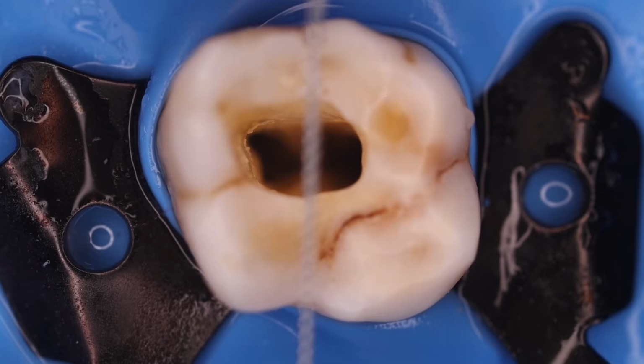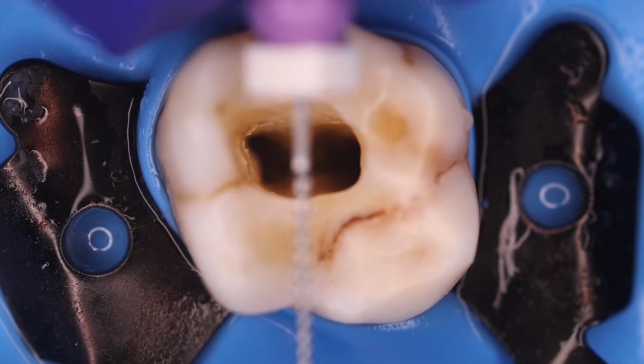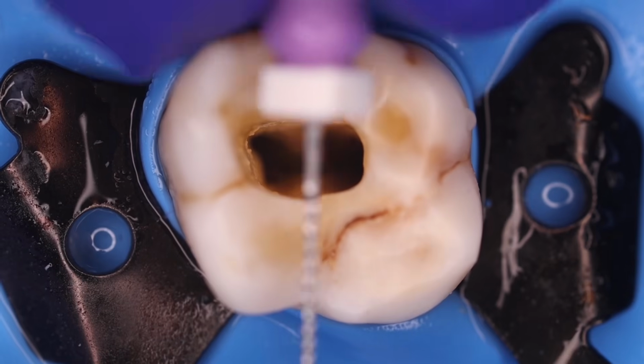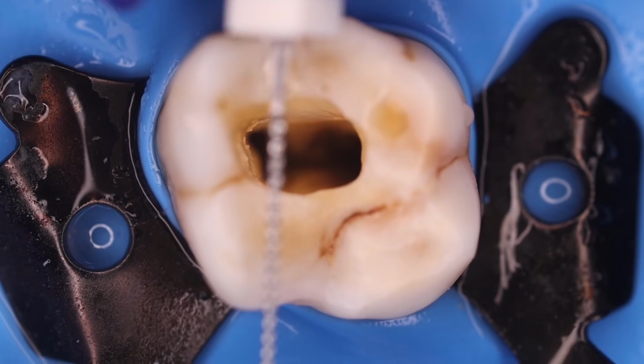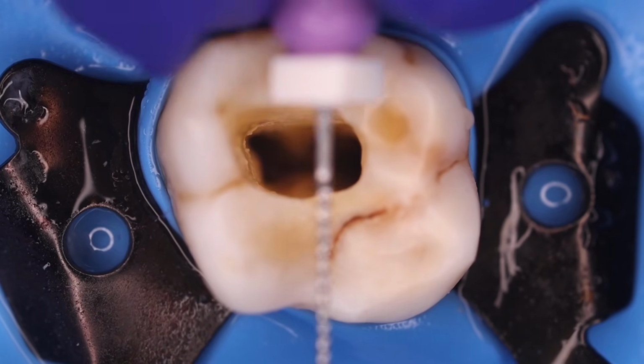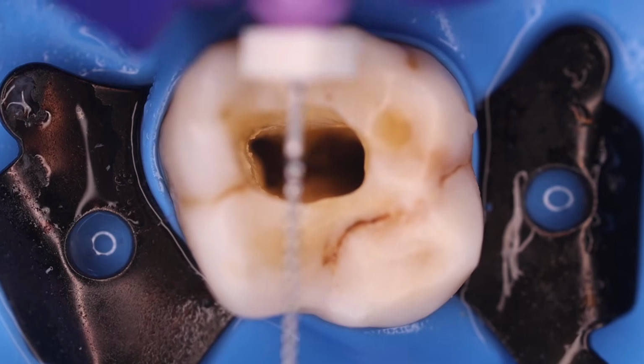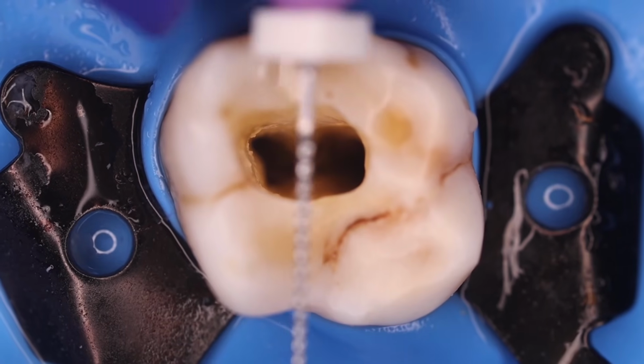And now we will use the 10 K file to initially negotiate the canals. For the orifices that we have located, we should be able to insert the file into the canal orifices up to the length of the root.